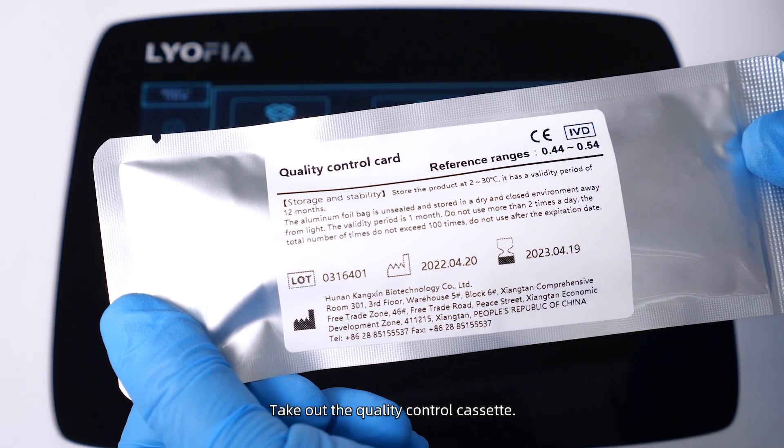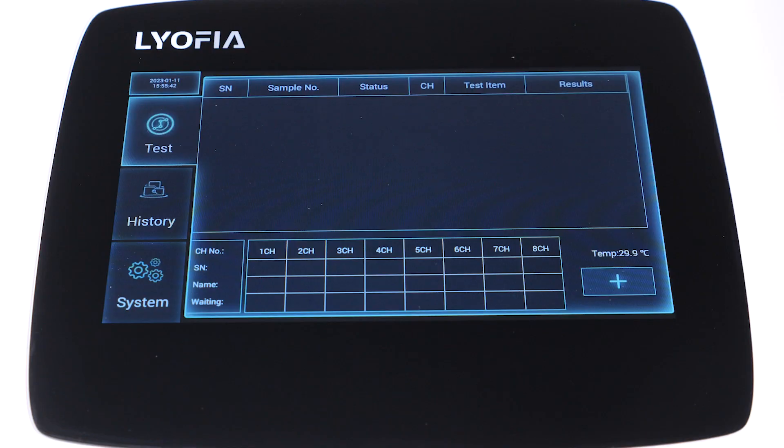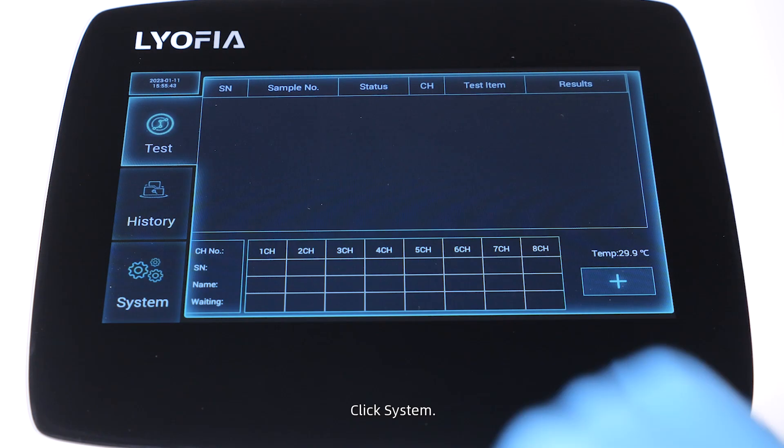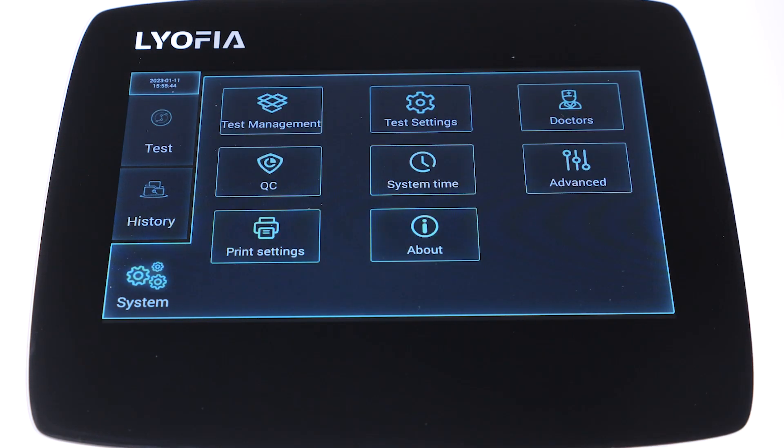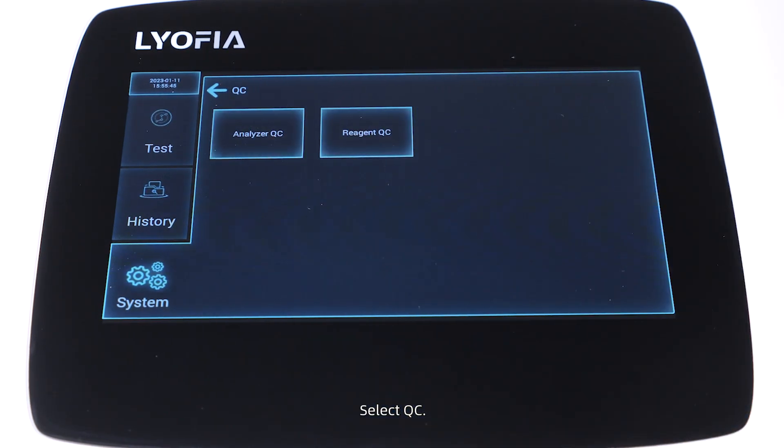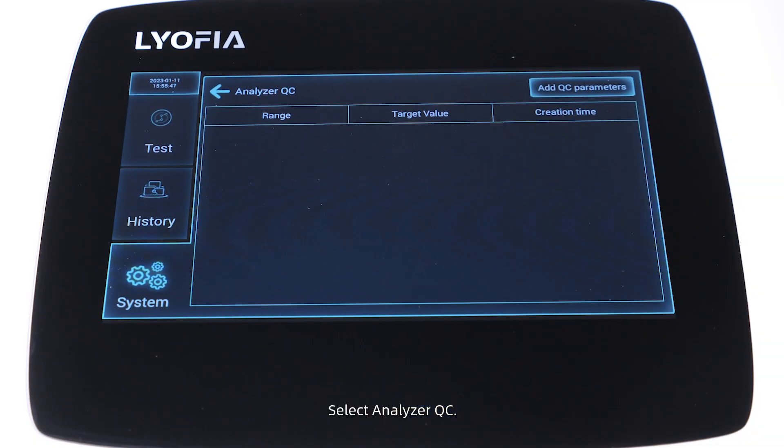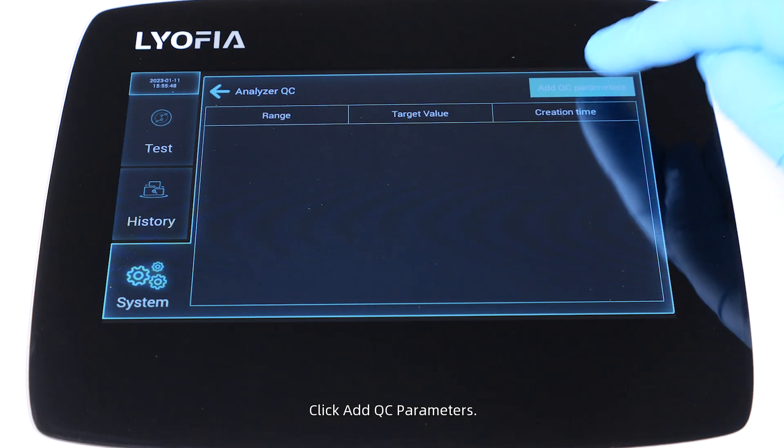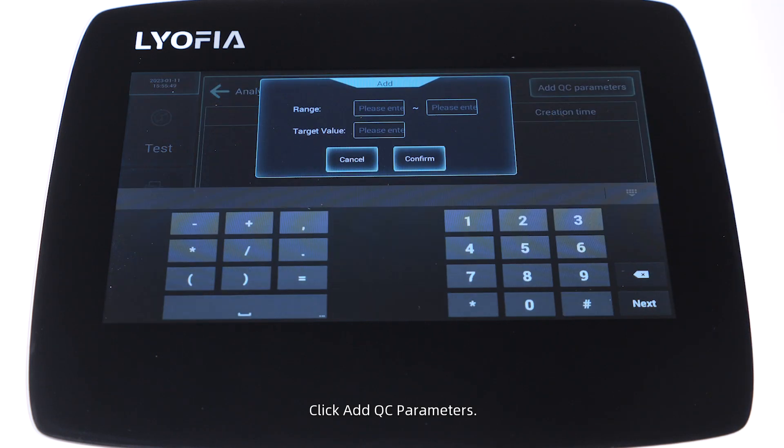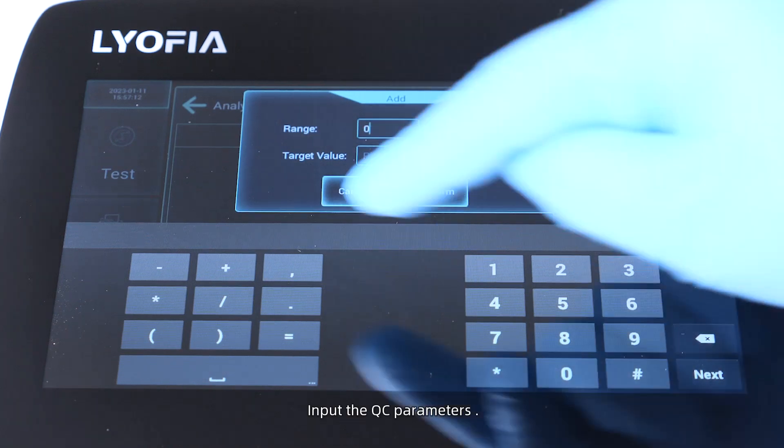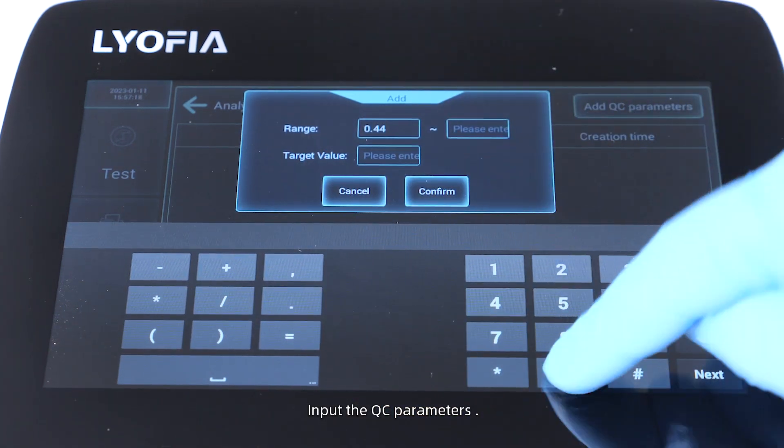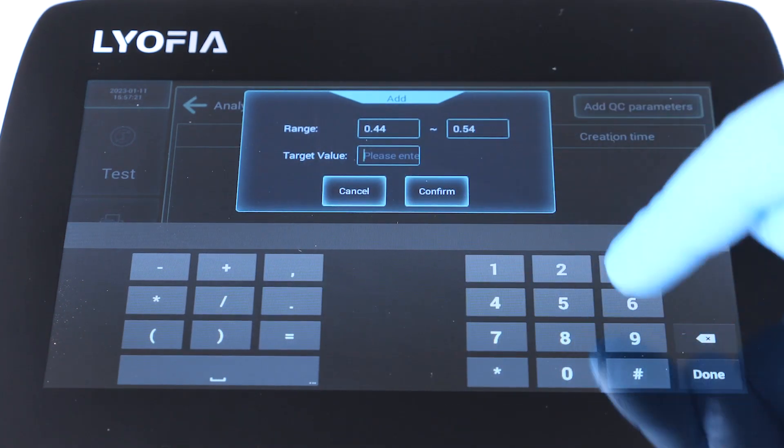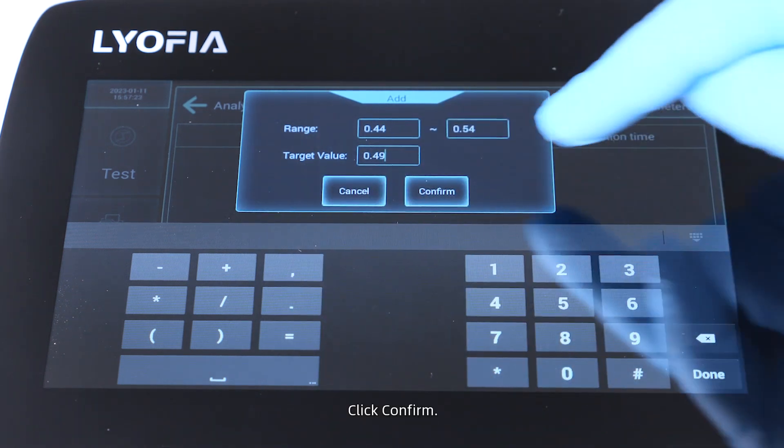Click System, select QC, select Analyzer QC, click Add QC Parameters. Input the QC parameters and click Confirm.